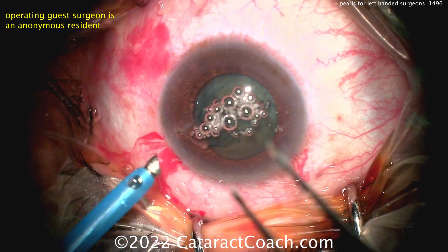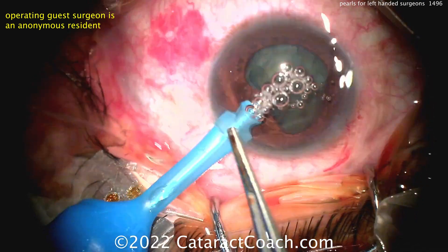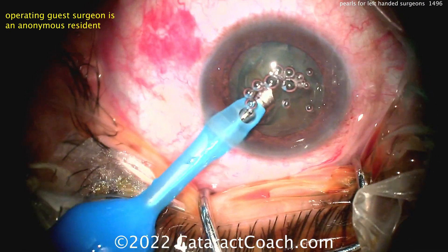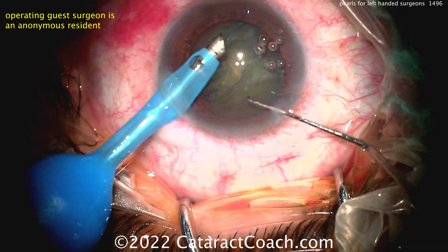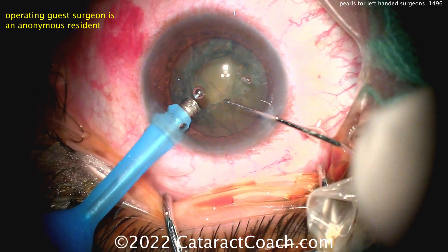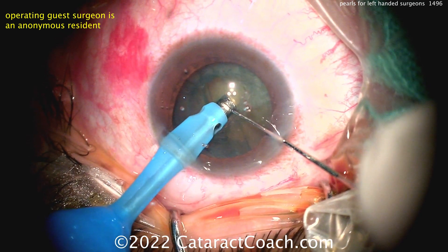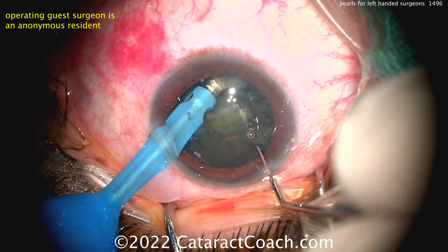If you are a beginning surgeon starting off doing FACO, you may want to try using the FACO probe in your non-dominant hand, and then the chopper in your dominant hand. Try that — do it in the wet lab and see what it feels like. If you have good dexterity with both hands and they're relatively equal, then I don't think it really makes a difference. You can use your right hand for the FACO probe and left hand for the chopper, or vice versa.